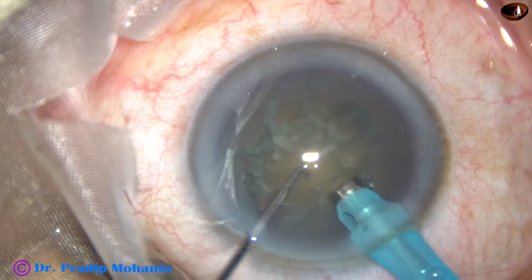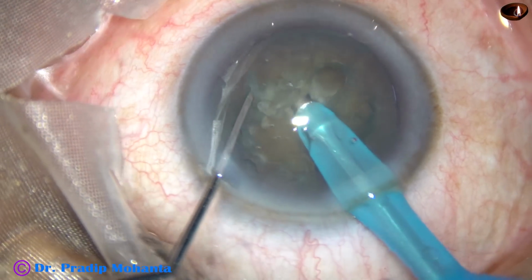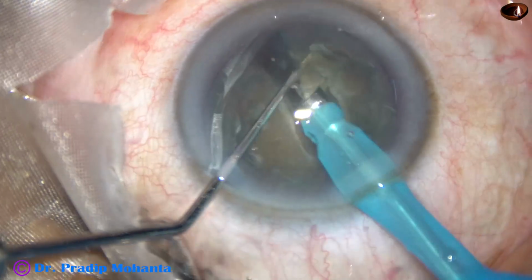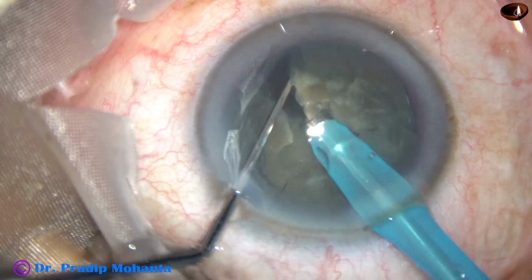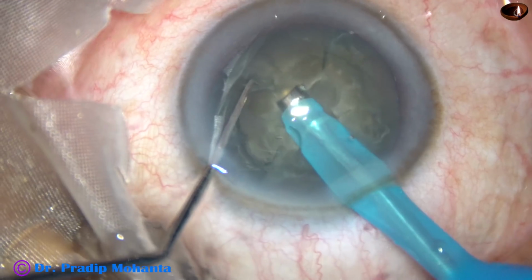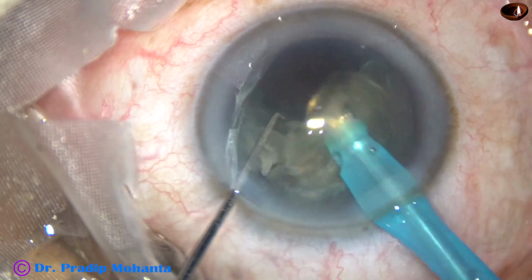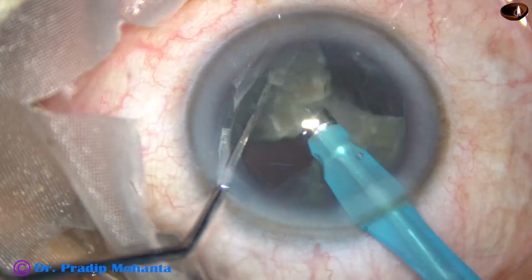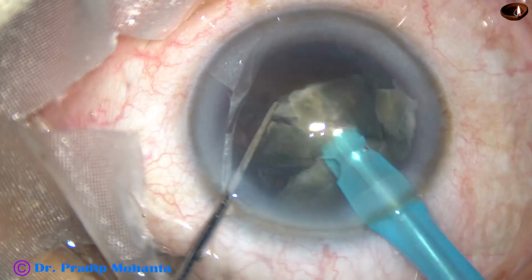And here it is. Bury the tip into the substance of the nucleus, hold the nucleus firmly and chop it. This was easy. Then I chop this heminucleus and this other heminucleus is also chopped into 2 fragments. So the nucleus has been divided into 4 fragments. Each fragment is being emulsified and removed. And now see what happens.